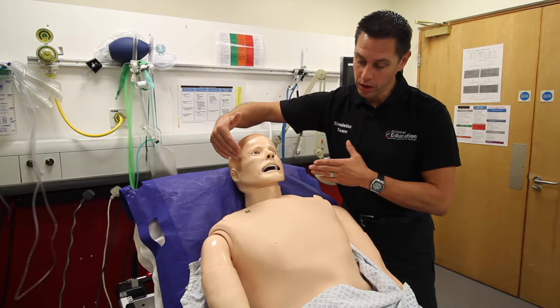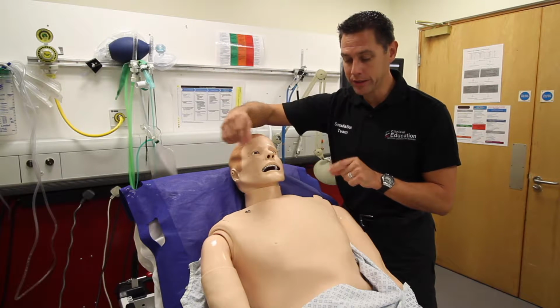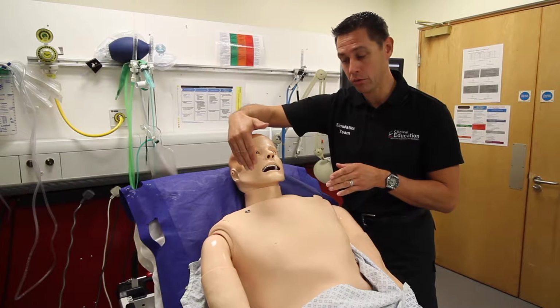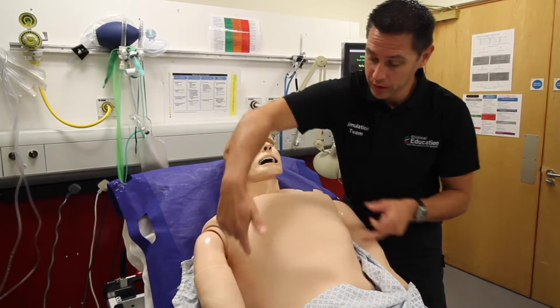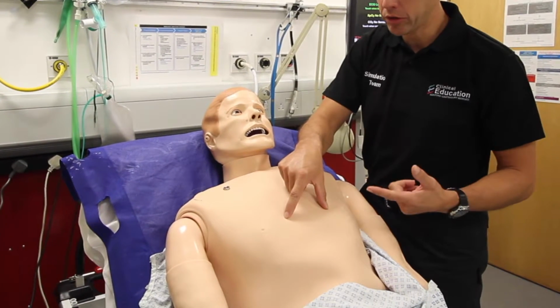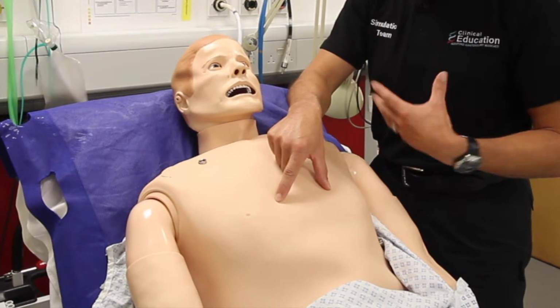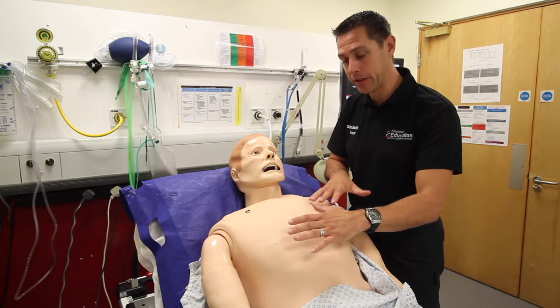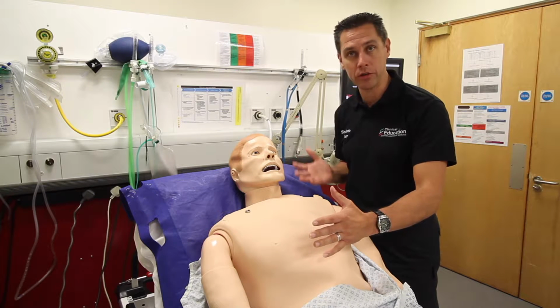In terms of his auscultation, he's got speakers in his chest. So when you're listening with a stethoscope, you need to be in the correct place in order to hear where the breath sound's coming from. So the speakers are in the front of his chest here, and they go down and then into the bases. And he'll have heart sounds approximately here. But we'll show you a little bit more of that later, where we'll show his inside working, so you better see those speakers. He's got chest sounds on the front, so his anterior aspect, but equally you can sit him forward and you can listen to the posterior aspect of his chest as well, so he's got speakers on both sides.